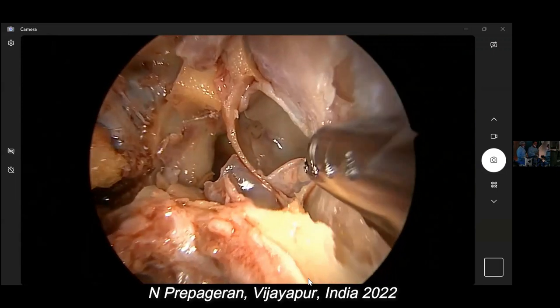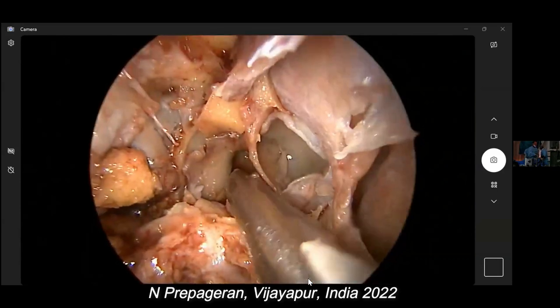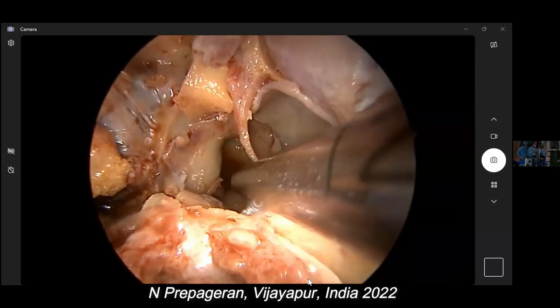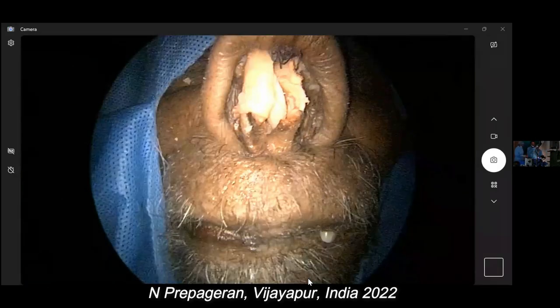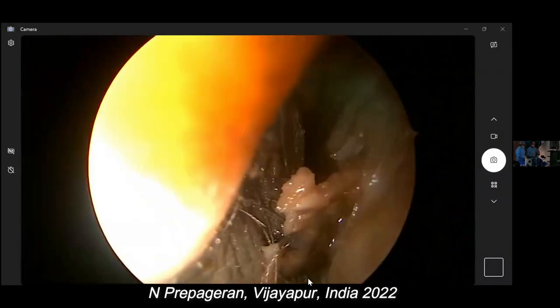Is that okay? This is not sphenoid, by the way. This is sphenoid. This is not sphenoid yet. There's a septum in between. Yes, it'll be nice if you have an IGS. An IGS would have shown all this very nicely. So you see, the problem is this. Can you see? This is what's making it difficult for us to operate.